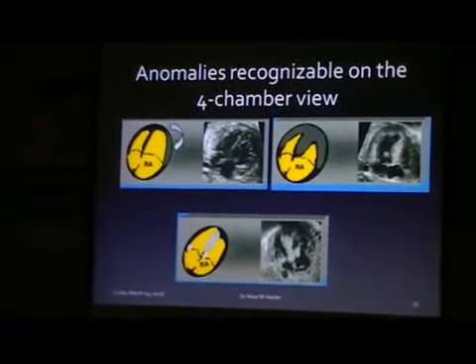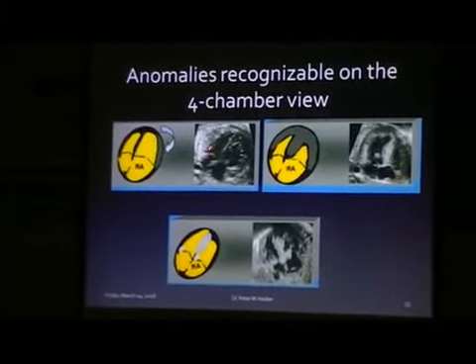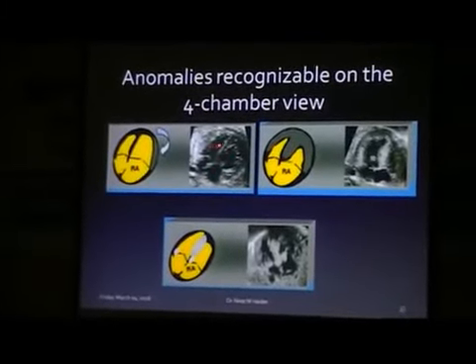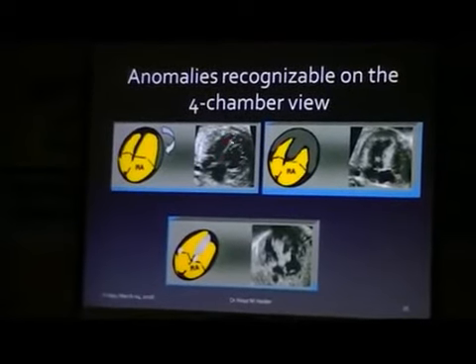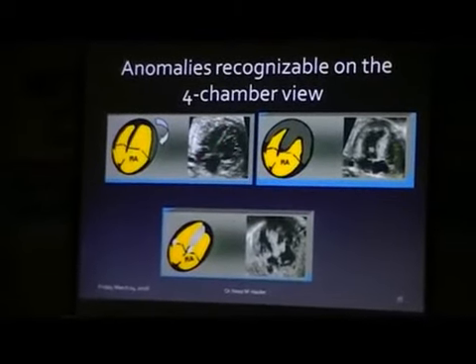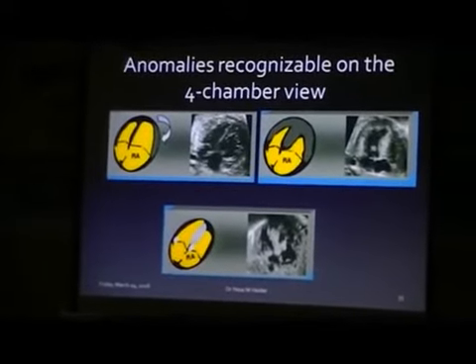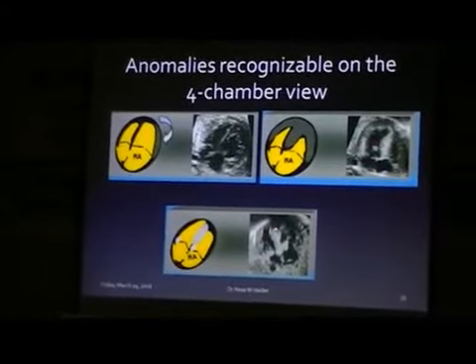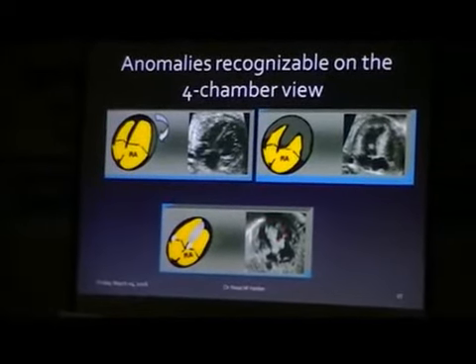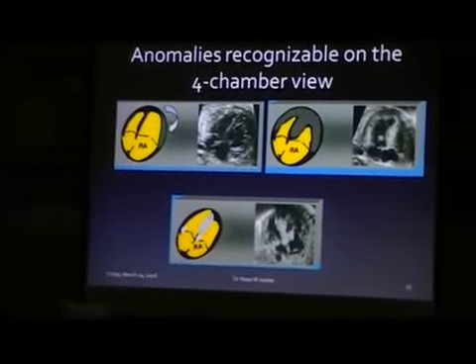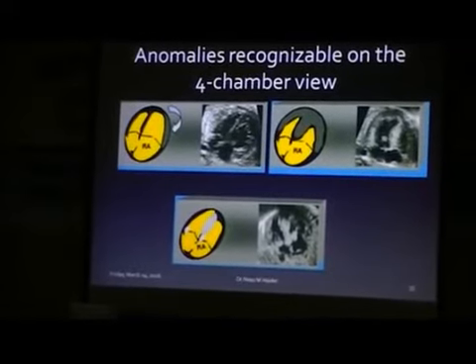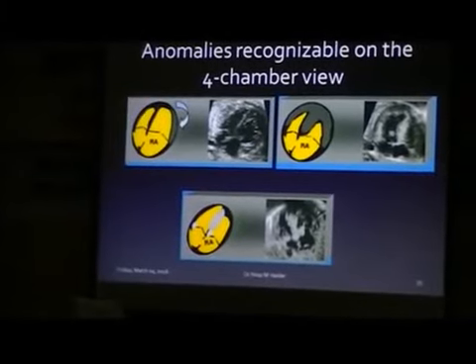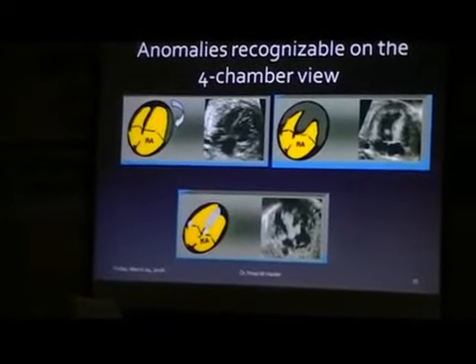Here there is disproportion of the ventricles — the left ventricle is small and the right ventricle is enlarged, and this is an indirect sign of coarctation of the aorta. And here, biventricular hypertrophy. And here there is a mass in the fetal heart, and on morning scans we can get some echogenic foci in the fetal heart, which can indicate abnormality.